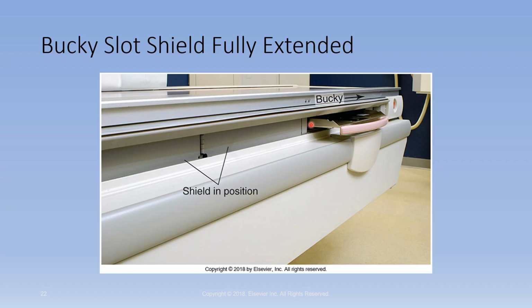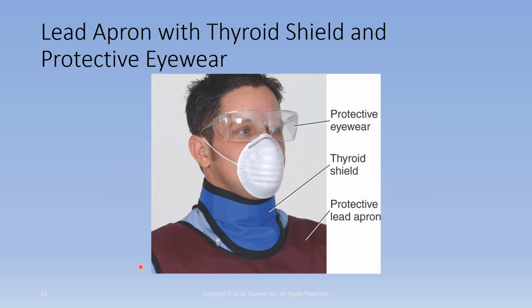But if you're wearing your lead apparel, as you should, then even if radiation were to get through there, it would likely be absorbed in your lead apron. Okay? Those lead aprons, just to make a point with this, have to have a 0.5 millimeter lead equivalency, and that is because when we operate above 70 kVp, that is what is required for the lead aprons.